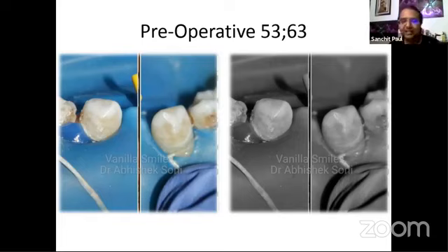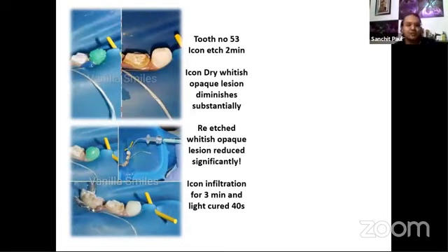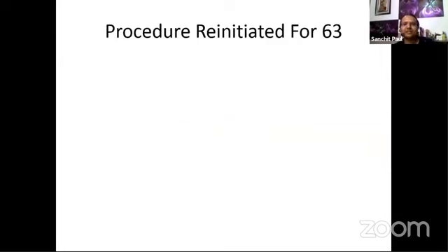We also want to highlight that a lot of times we see the primary canines are not broken, but they are demineralized and have those white spot lesions. Again, one can use resin infiltration in those cases in trying to mask those white spot lesions and actually make them hard, shiny, and biofilm free. So this is something which has been working wonderfully.